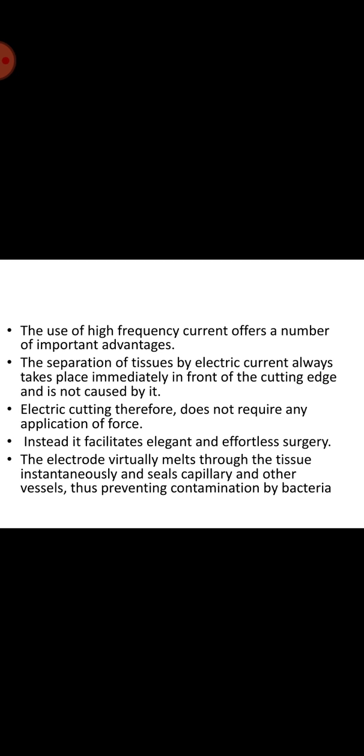Despite the fact that surgical diathermy machines have been routinely employed for over half a century, the most significant technological developments have occurred within the past decade only. Solid-state generators have replaced a substantial number of vacuum tubes and spark gap units. Self-adhering disposable electrodes are now widely used in place of the large area butt plate. A number of design features have enhanced safety, and these include a variety of circuit integrity monitors like disposable electrode cable continuity, patient circuit continuity, and alternative path current monitors, among others.